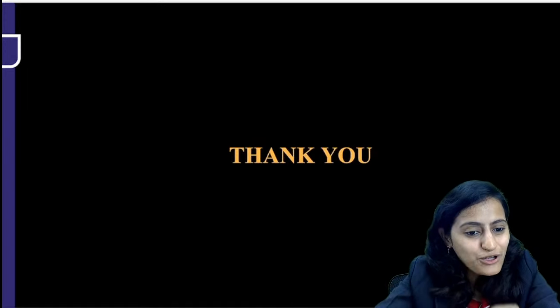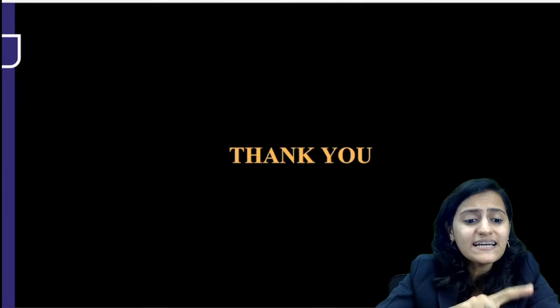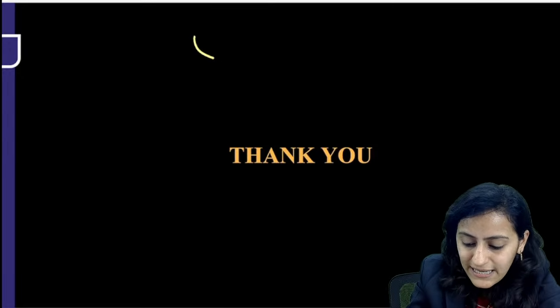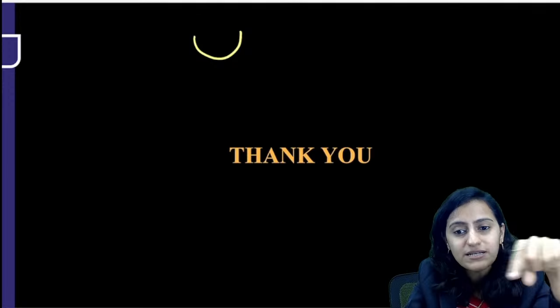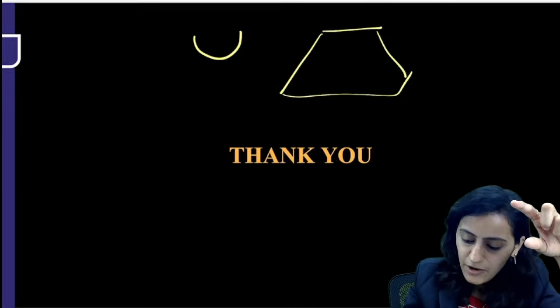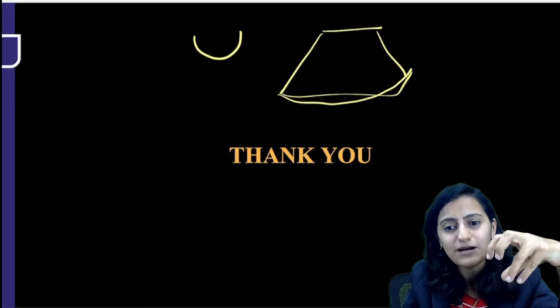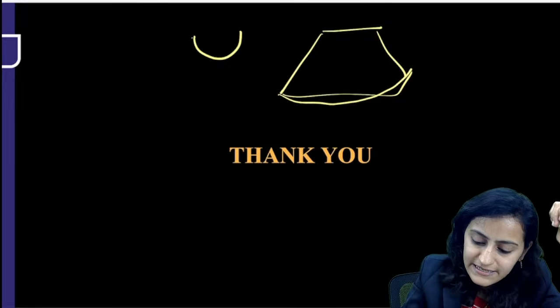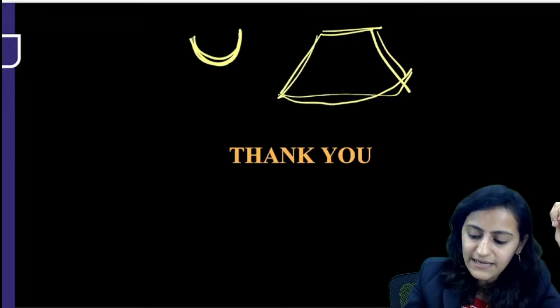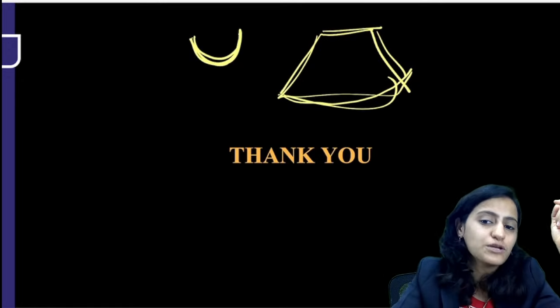Yes, Sagla Charan, your query that TAS versus TVS, you differentiate by the image. In TVS, you would see this round part above. In TAS, the image would be like this. Try to just see some images, Google out some images. In TVS, the probe section you would see like this. In TAS, it would be like a quadrant like this. It would not have a circular part.